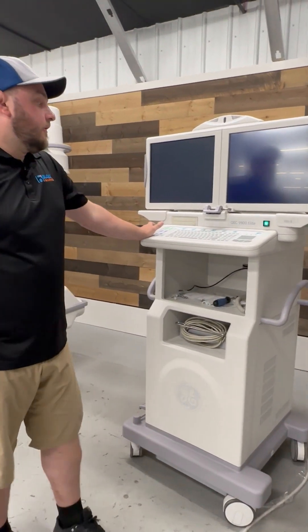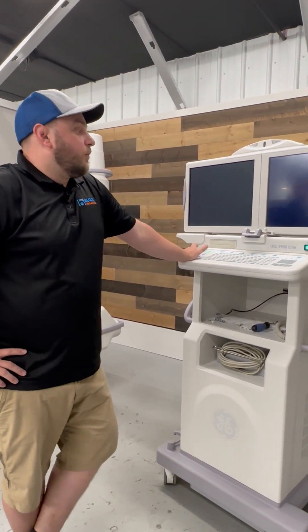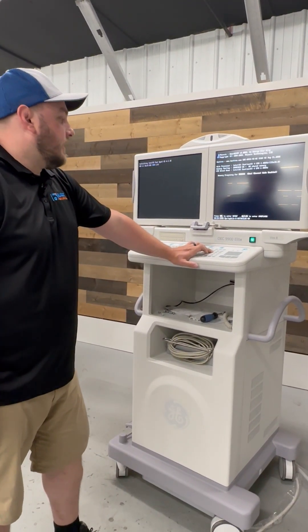Now what that little dip switch does is it turns our monitors into service mode so we can go back in and reset the BIOS. With the system booting, hold the delete key on the keyboard.